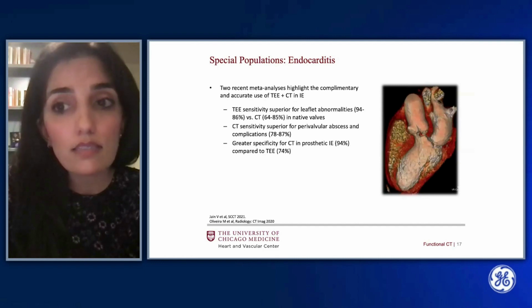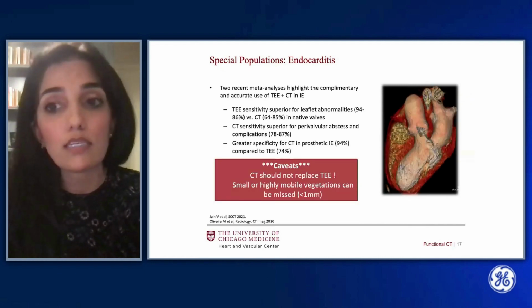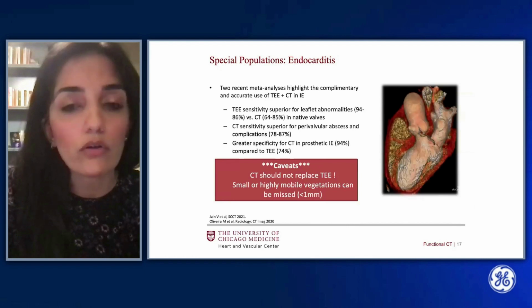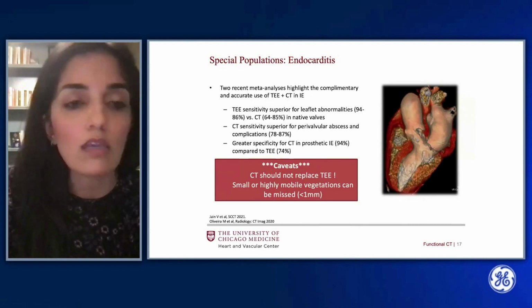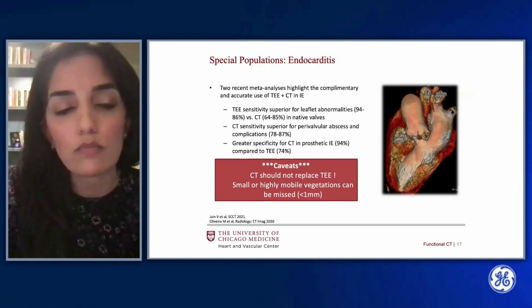This is not to say that CT is a bulletproof test, however, as it should not entirely supplant TEE, because we know that CT can, on occasion, due to limitations of temporal resolution, miss smaller or highly mobile vegetations. Regardless, lots of promising data for use of CT in this particular arena.